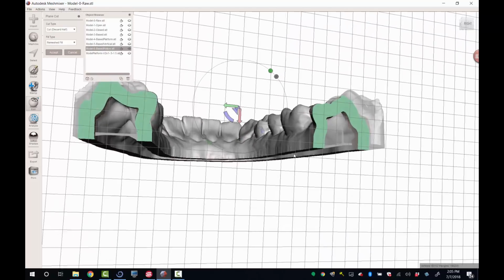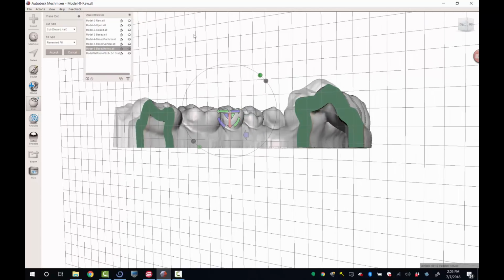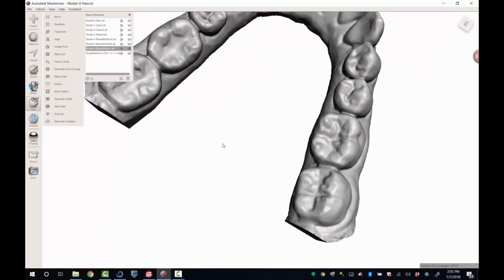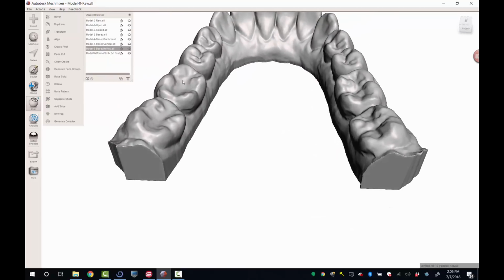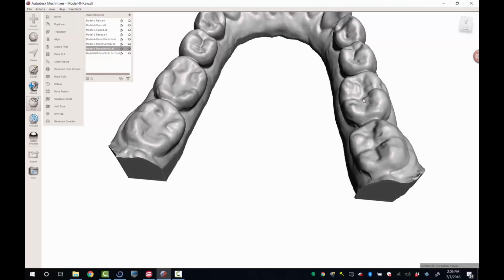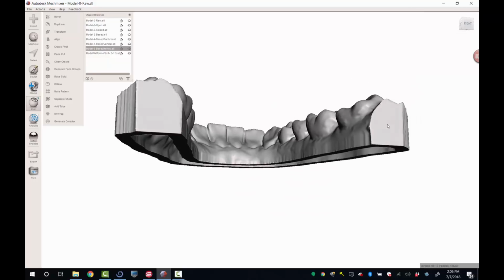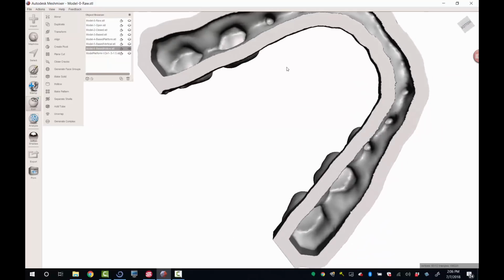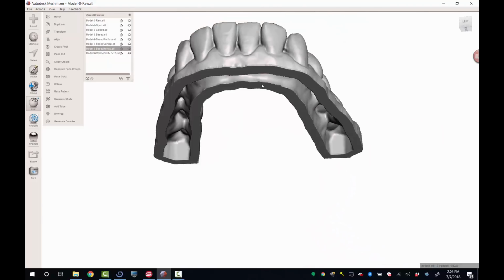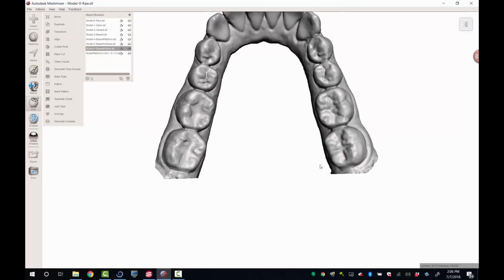So that's why I don't necessarily recommend printing hollowed out models horizontally. But if you look at these teeth, they do not have deep grooves. She has occlusal fillings in these teeth, and these just don't have real sharp grooves. If they're really steep grooves, you could run into problems. So anyway, I don't advocate that. It would probably work on this one, but just keep that in mind. This is set up well for printing vertically on these heels.